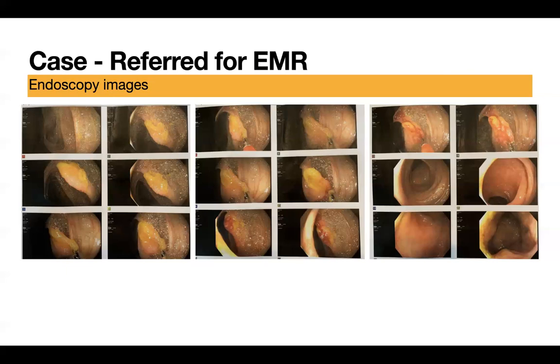I want to convince myself. I've actually made mistakes where somebody has had a cholecystectomy and there's a lot of scar tissue in the right upper quadrant, and you can actually imagine yourself that you reached the cecum, and everybody around you could also be convinced that you reached the cecum. And one way to get out of that problem is to say to yourself, okay, I won't say it is cecum until I see the valve or until I see the terminal ileum. So that's something to keep in mind.